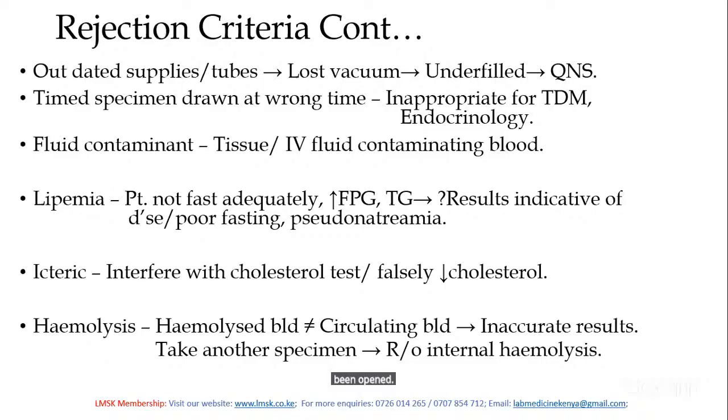When there's lipemia, a lipemic specimen, you reject. The lipemic specimen is cloudy, milky. You reject because it interferes so much with the clinical chemistry analysis. That's why in some tests we request the patient to fast.